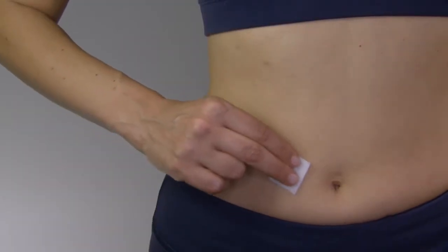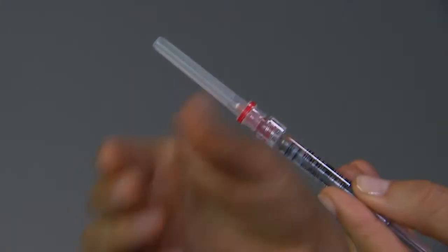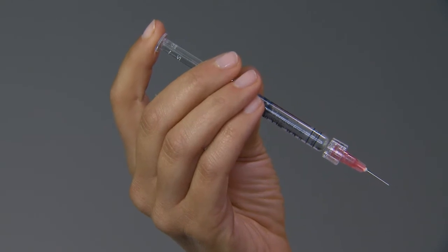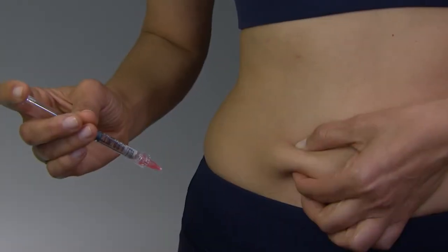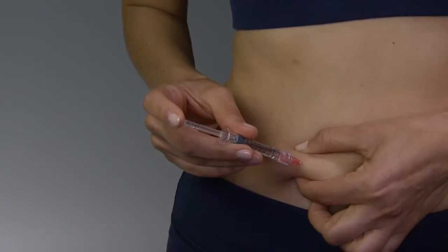Clean the recommended injection site with an alcohol swab and allow it to air dry. Uncap the injection syringe. Hold the syringe in one hand the way you would hold a pencil. With the other hand, pinch the skin around the injection site. Insert the entire length of the needle completely straight into the skin at a 90-degree angle.